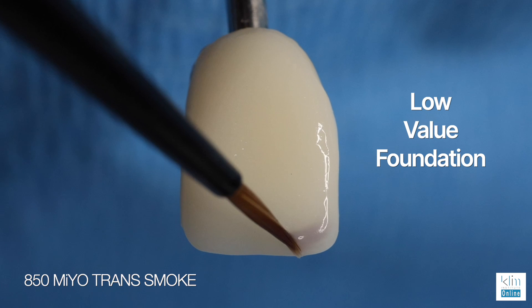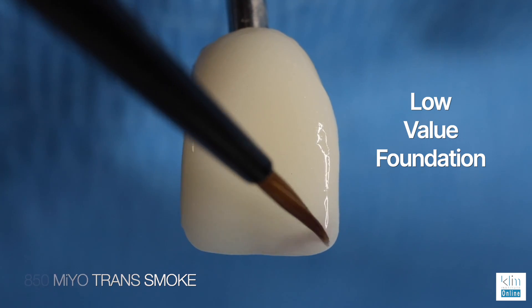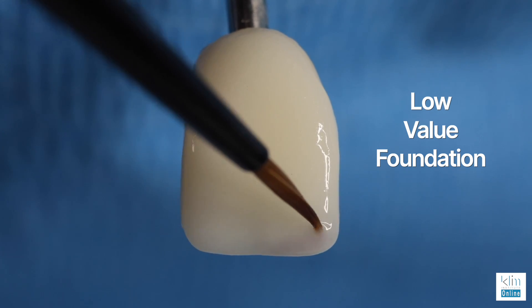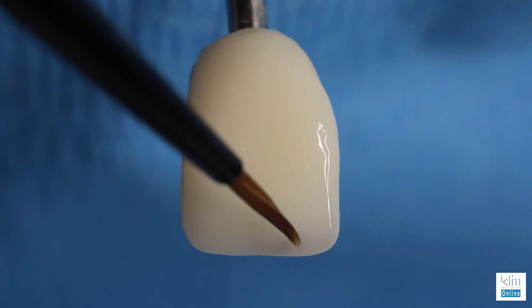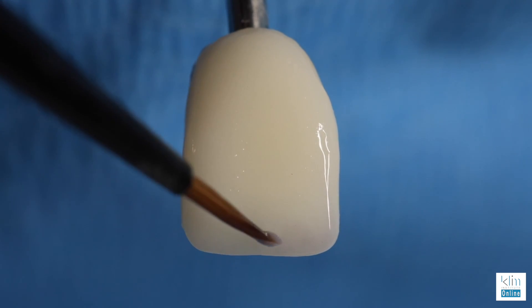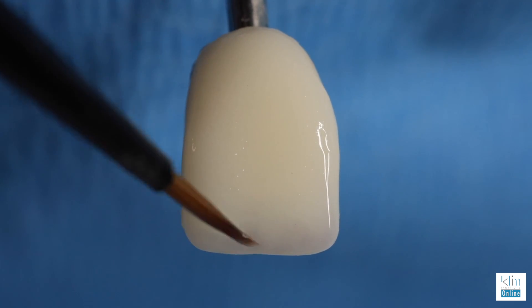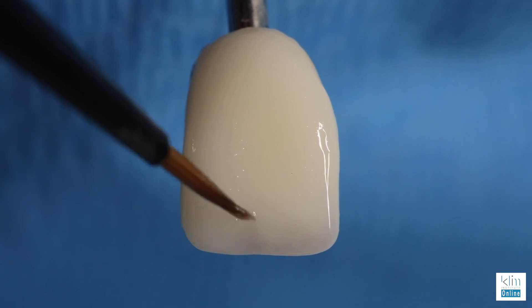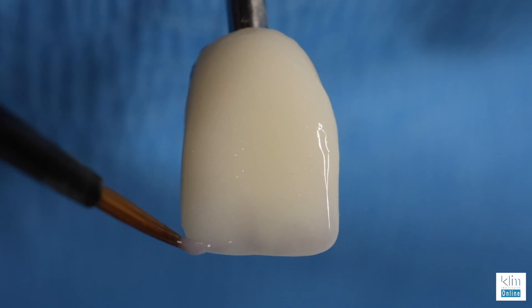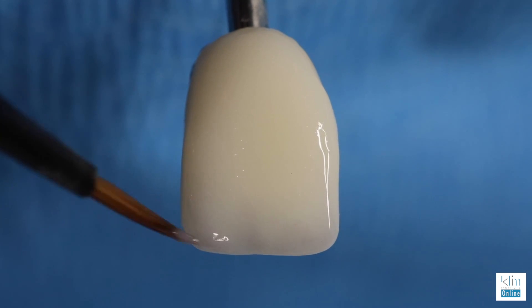Our first step in adding and creating the illusion of a beautiful incisal edge is adding smoke. Extend it around the line angles as applicable for the case, and then at the incisal edge, keep it about a half a millimeter from that edge. Feather that low value effect down into the primary grooves. This is what we call our low value foundation, and from this, this is our working palette from which we'll add all other colors.